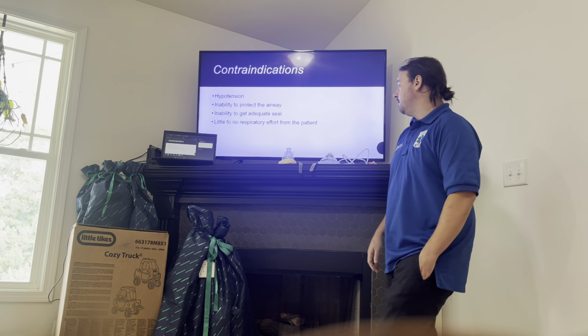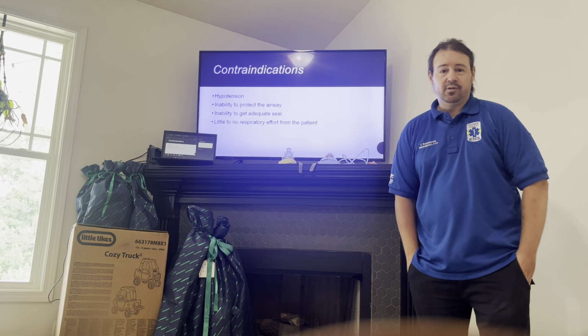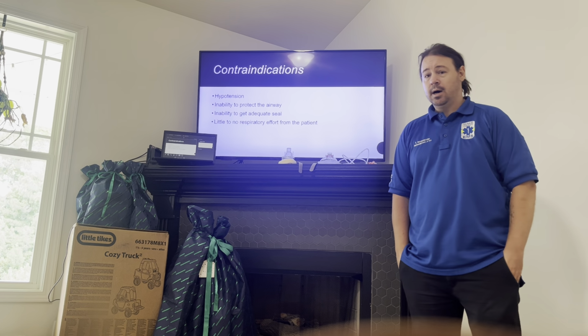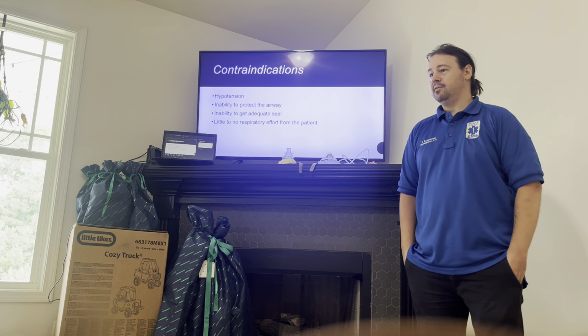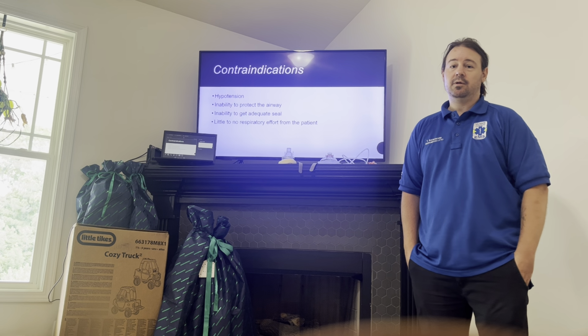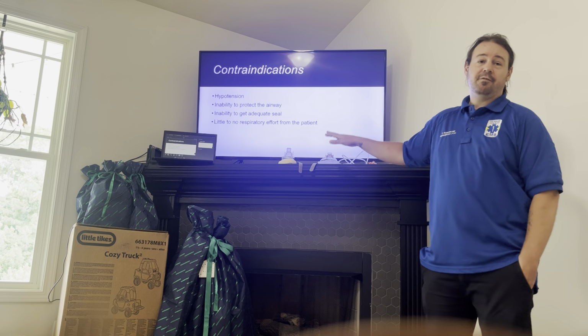Anytime you have a difficulty getting an adequate seal, if you cannot get an adequate seal with a CPAP for whatever reason, maybe limited resources, or the patient has wounds or damage to their face, making a seal difficult to acquire, then we're not going to use it because it's not going to be effective if we don't have a good seal.